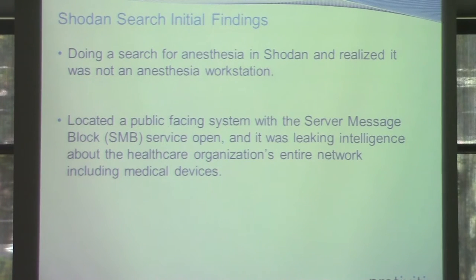And when I speak about medical devices, you want to be careful to identify what I mean. A lot of folks, if you think medical device, you'll think maybe just the infusion pump itself, right? Or any vulnerabilities inside the infusion pump. But it's really an ecosystem, like I said. These things are networks. So infusion pumps are almost always on wireless, almost all of the time. The reason is they talk to a centralized server that holds and pushes out things like drug libraries down to the system. So they're always on the network. So you can find other flaws in those types of systems, things like that.